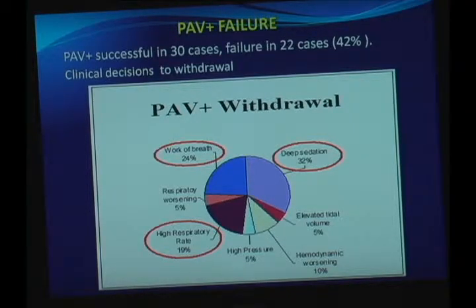So I mean, did you have guidelines that said when the respiratory rate exceeds X, you need to transition? When the work of breathing exceeds X? Yeah, but we also have a last point, which was judgment: as much as the physician thinks that this is not good for the patient, you can also switch. And that's tough for both of those, because some physicians will believe a rate over 20 is too high. Others, a rate over 35 is still acceptable. So the variability amongst individuals can be huge.